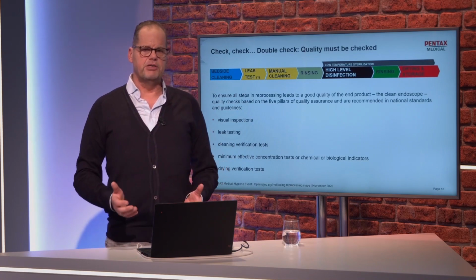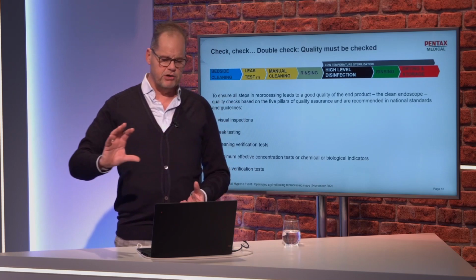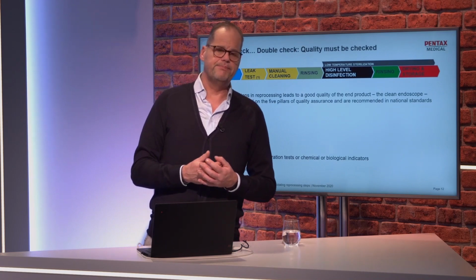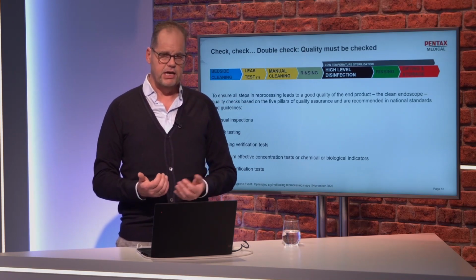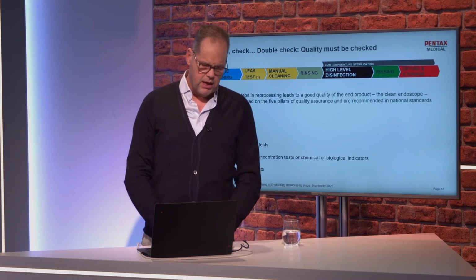Check, check, and double check. Quality must always be checked. The whole reprocessing chain, every step must be checked. We can do that by improving visual inspections, by leak testing, cleaning verification tests. We also discussed the microbiological sampling.